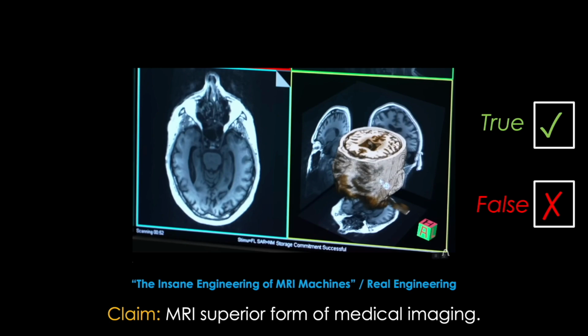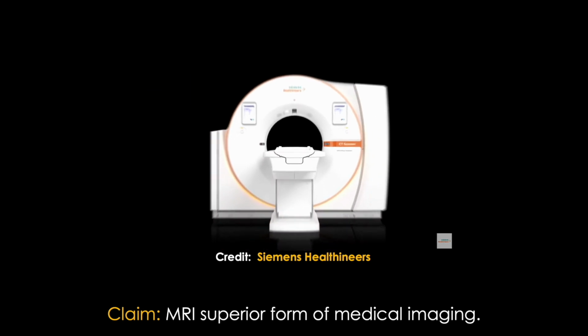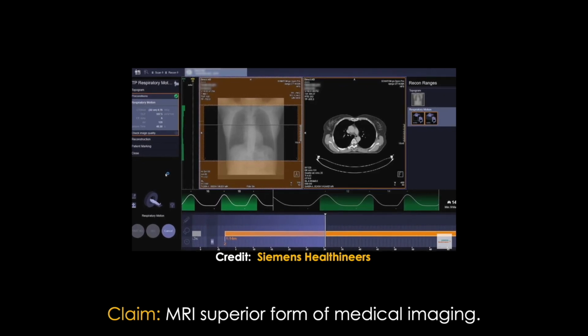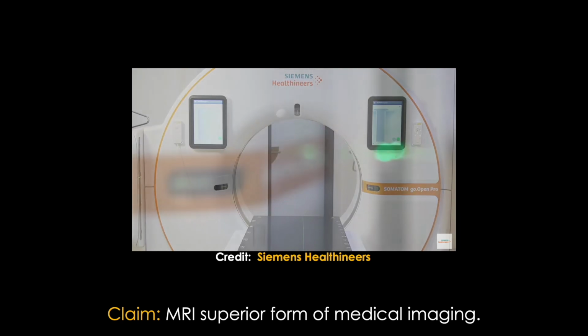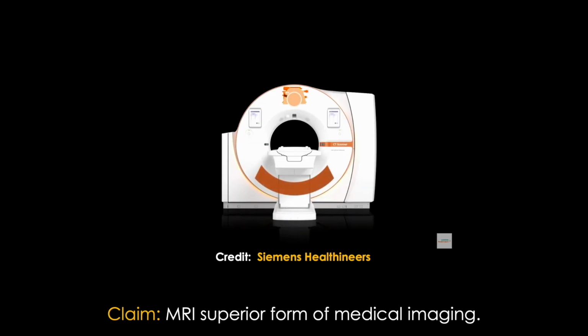False. But sometimes true. There are several claims here we need to address, both historical and technical. They failed to mention, I think likely intentionally because it might take away from the awe of MRI, the most popular form of cross-sectional imaging and maybe the most popular form of medical imaging in hospitals, computed tomography, or as you know it, a CAT scan.